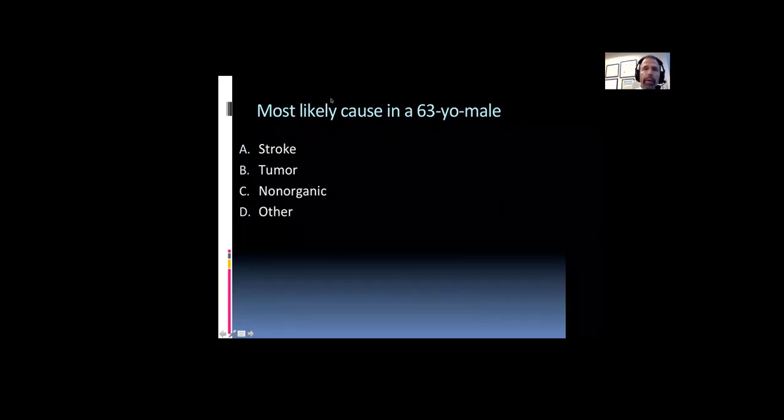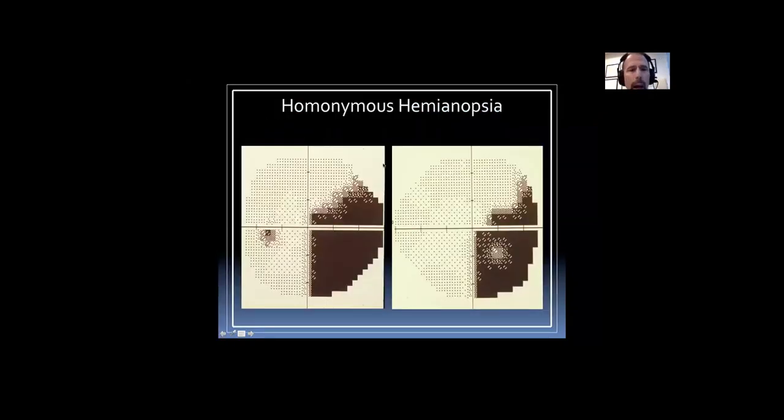Interestingly enough, this visual field is a field that I did because I needed this for a book chapter, frankly. And my point is here that anybody can do what they want in this test. I was pretty good. I did start beeping in the bottom right there when I remembered I wasn't supposed to, and that's why you have this little area right here.